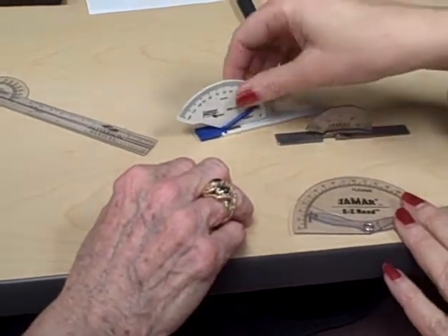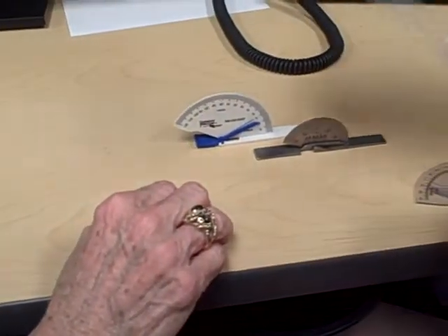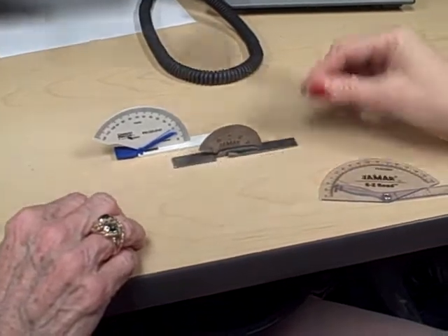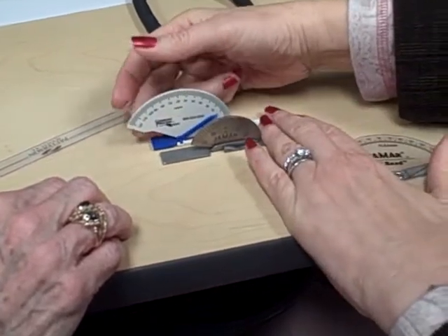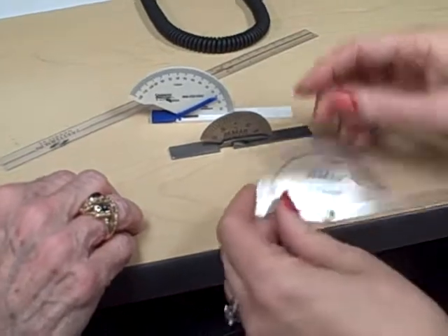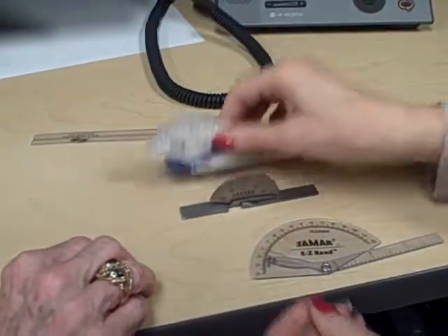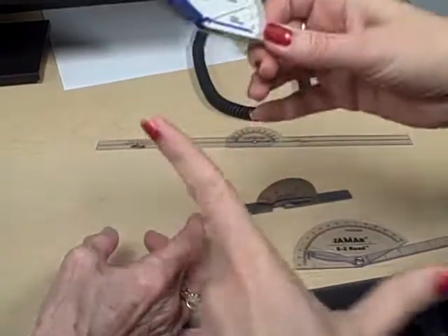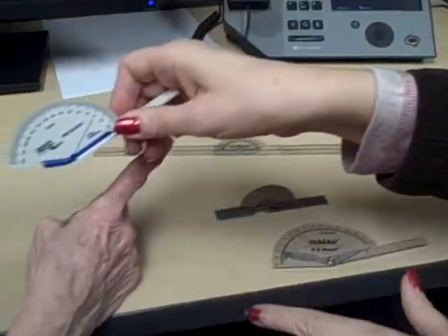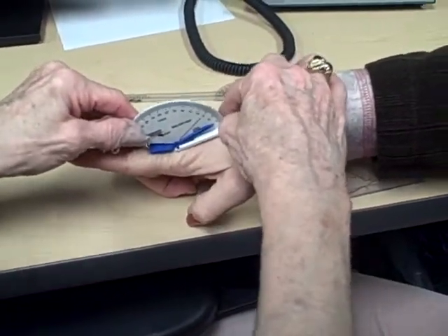Now look at another difference between these three goniometers versus this one. On this one the two arms will lie completely flat, but on these others the arms lie flat while there's a space — a cutout — in here. The purpose of this is that these goniometers can measure hyperextension. Whereas when the flat one is at zero, it's flat; but here at zero there's still space. So if someone has some hyperextension, the goniometer will fit right in there and measure up to 20 degrees of hyperextension.